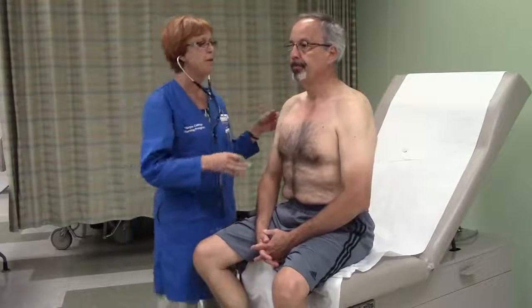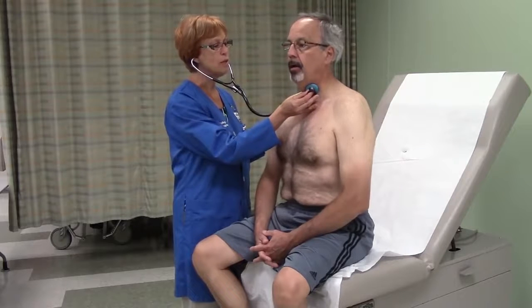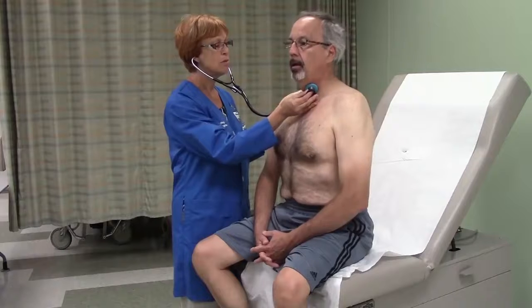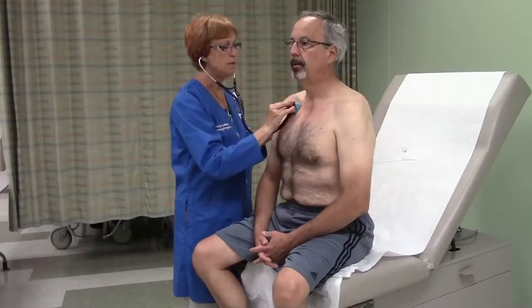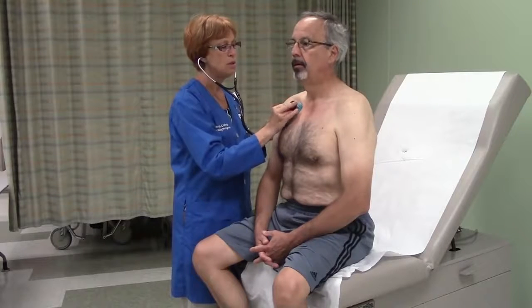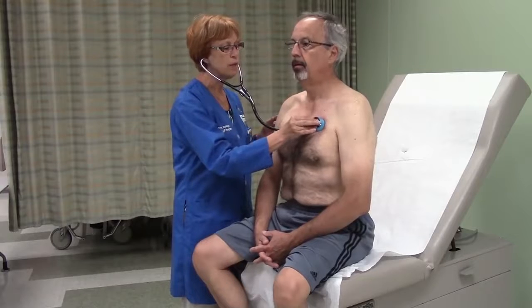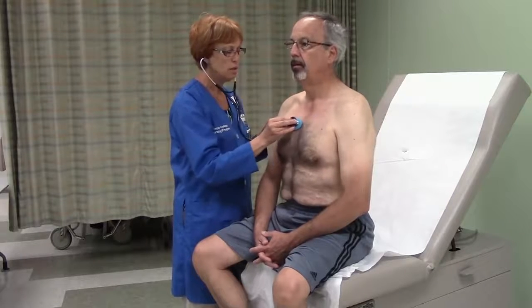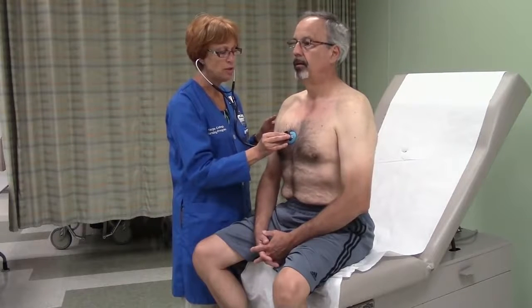And then I'm going to continue with my assessment by auscultating lung sounds. So I start auscultation at the trachea. And then I want you to open your mouth and breathe a little bit deeper than normal, in and out. Not too deep, just a little bit deeper than normal. Good. And then I'm going to continue listening. I listen to a full breath in each spot. And I compare side to side as I go down the chest.